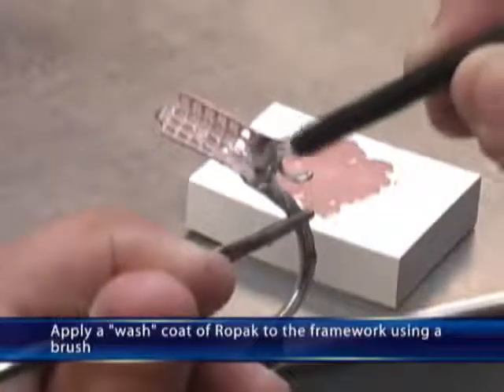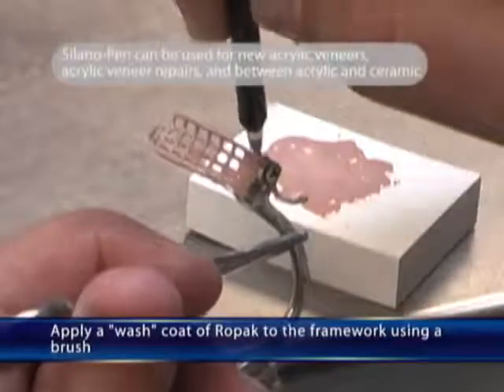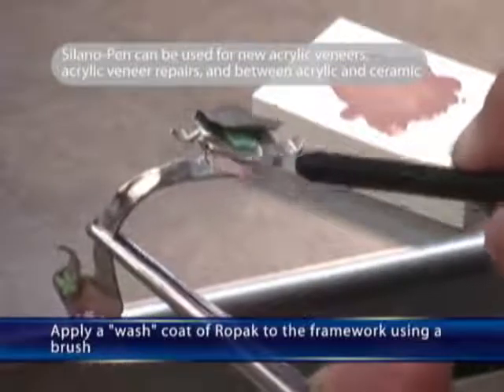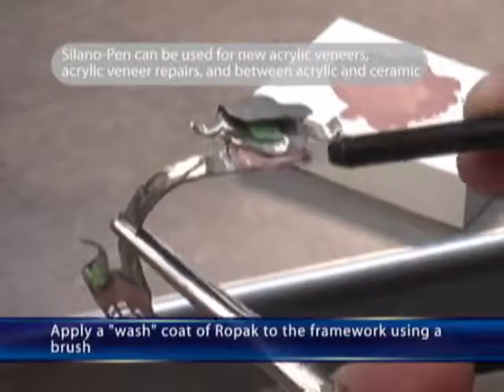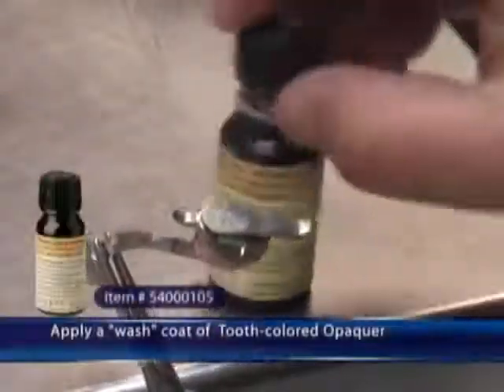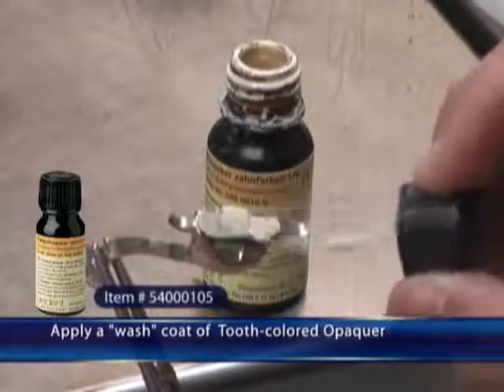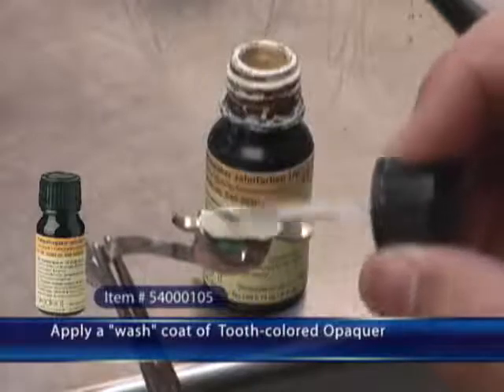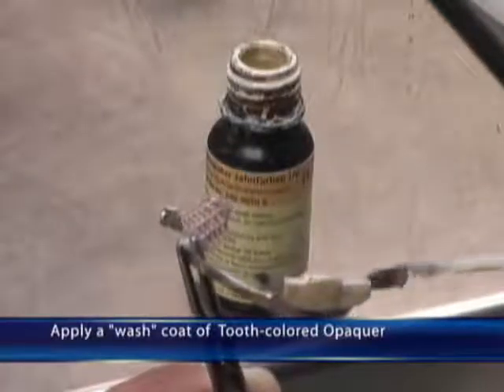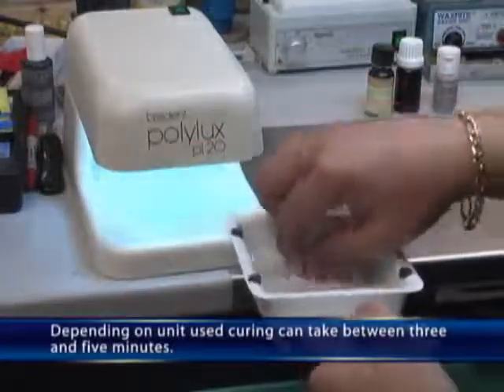Apply a wash coat of Ropak to the framework using a brush. Apply a wash coat of Tooth Colored Opaquer. Depending on the unit used, curing can take between 3 and 5 minutes.